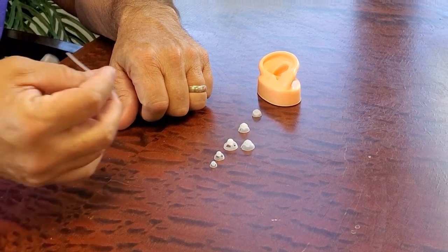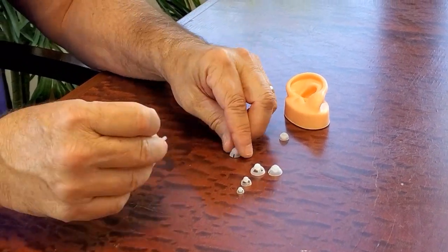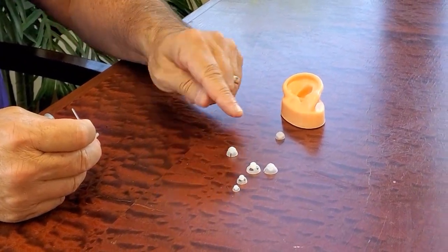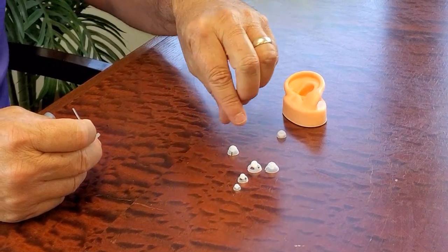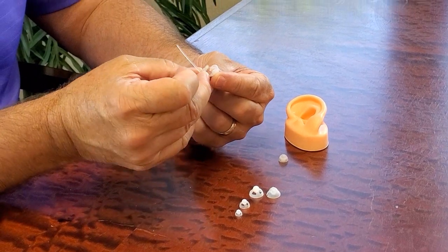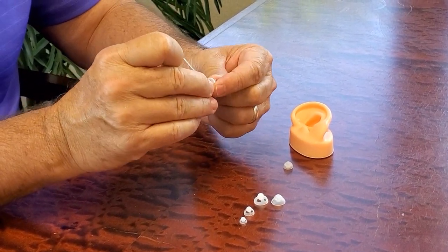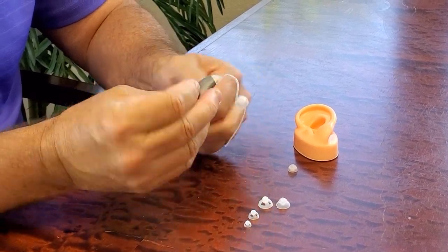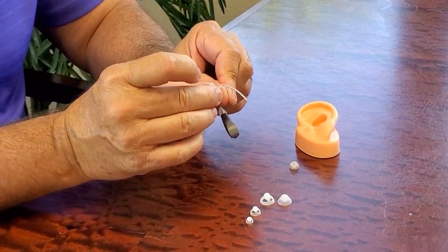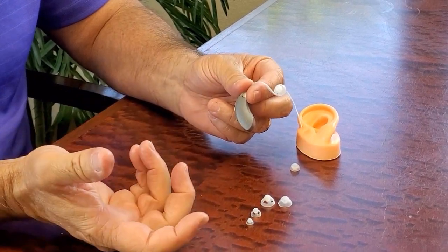Now I'm just going to show you how to install a dome on the hearing aid. It's like a bowl and we just put the bowl opening down. We take the end of the tube and put it right into the little hole. Just push it and that's it. Make sure that it's secure so that it doesn't come off in your ear, and you're done. Very simple.